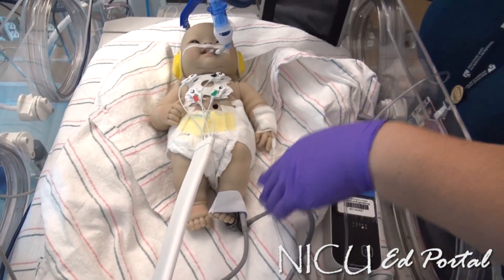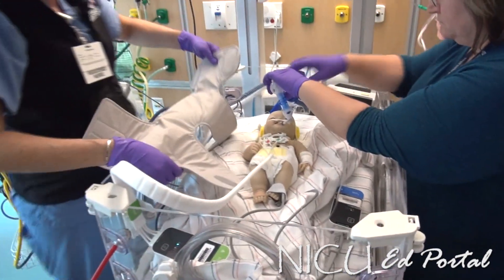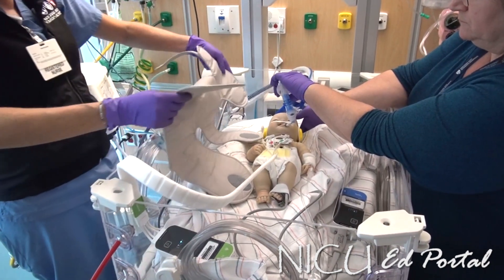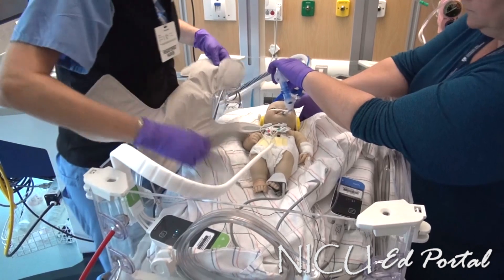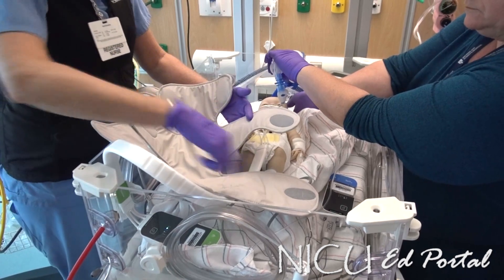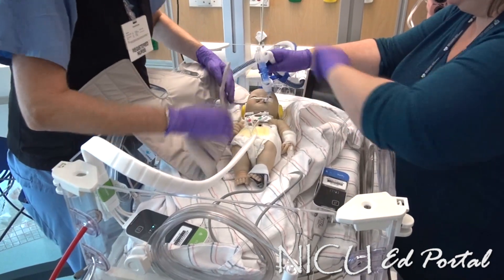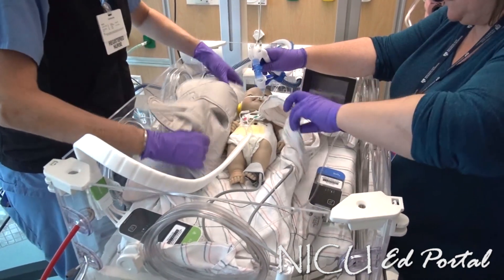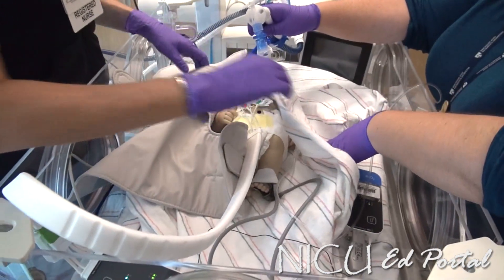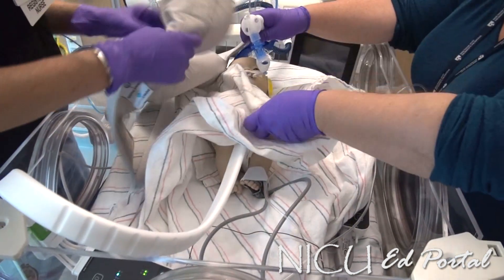This particular swaddle is different from what we've used previously — it is unique to the MRI on this floor. When you need to find this swaddle, you're going to find everything you need in the MRI suite. The middle piece goes around the trunk, the smallest piece for the head, and the bottom piece around his legs. We usually keep him on one blanket as well.